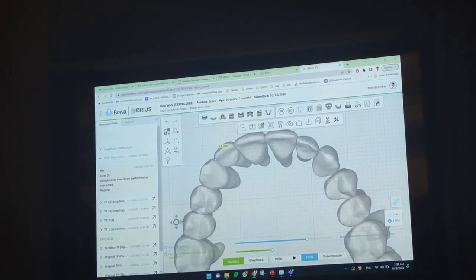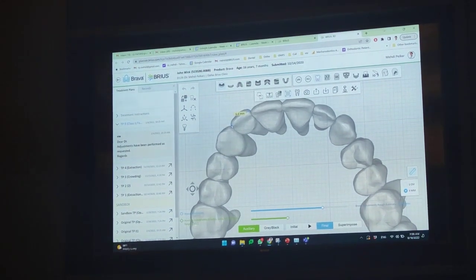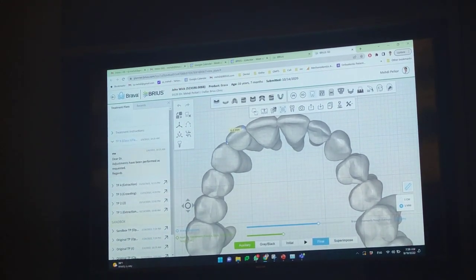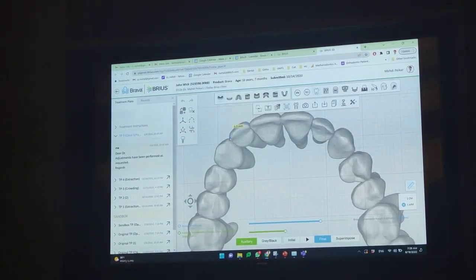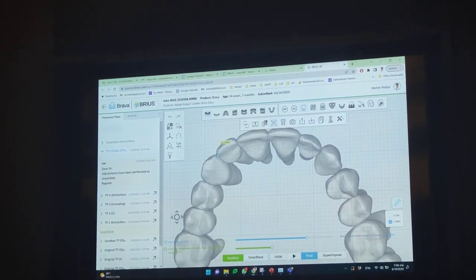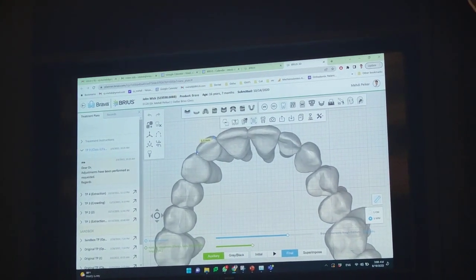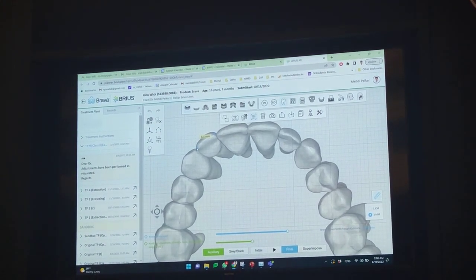No? Okay. Maybe I didn't understand the question. For example, I have a case where there were multiple very tiny laterals plus very tiny canines. So I work with my prosthodontist, and we say that we need 2.5 millimeters between these two and these two, but 2.2 here, so he has very specific spaces that he wants to park. Right. So in Align you can add space, or you can add IPR, just plus or minus. So can that be done something like that?